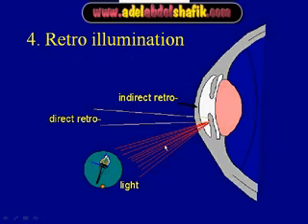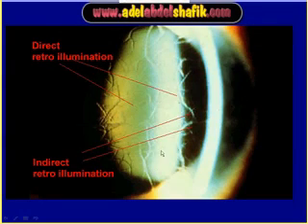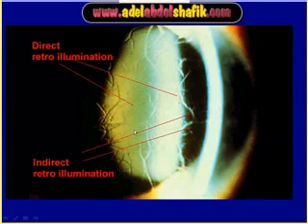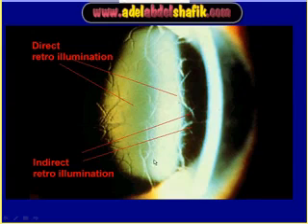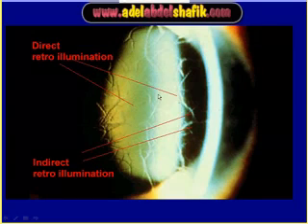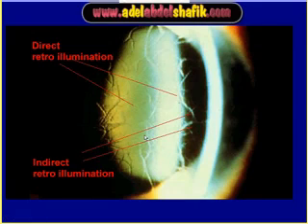If you put the light to the iris and start to examine the cornea, again this is a retro illumination. You can see here a section in the cornea — we are not examining that section but examining this part of the cornea. You can see some lines criss-crossing each other. These lesions in the cornea seen against the illumination coming from behind are called direct retro illumination.